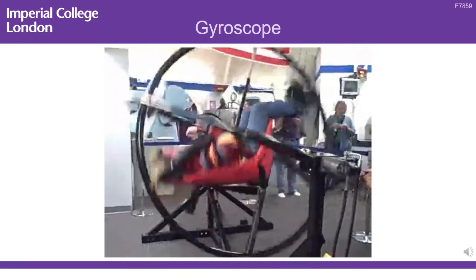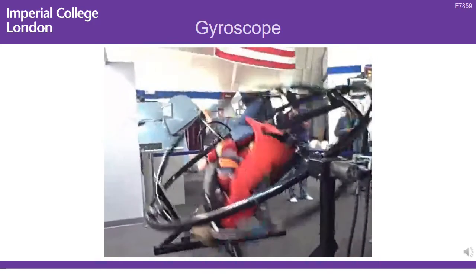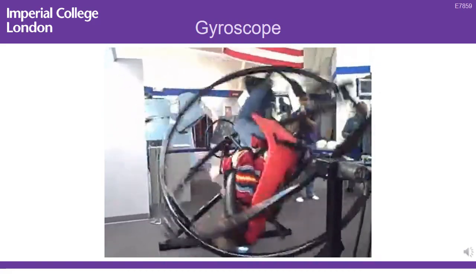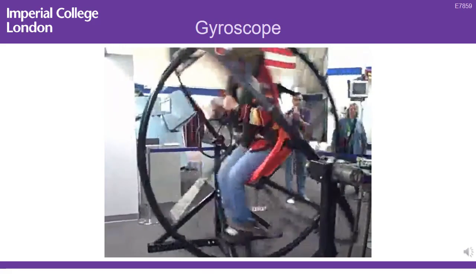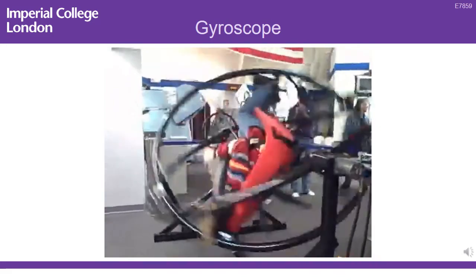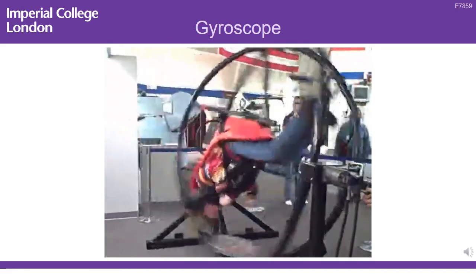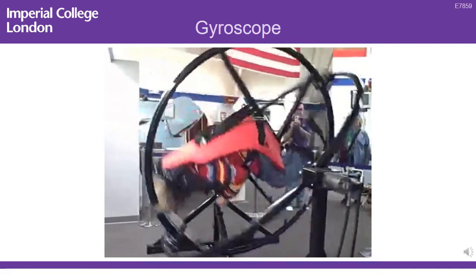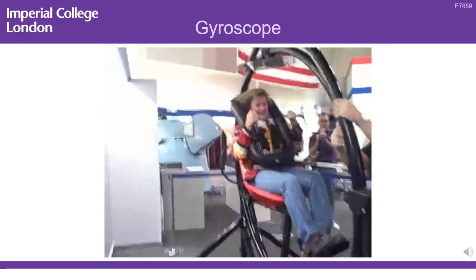Basically, gimbals are just pivoted supports that allow rotation of an object around a single axis. With 3 gimbals mounted together, each will offer a degree of freedom, so you get the yaw, the roll, and the pitch movements. This example has 2 black rings or gimbals. Not being a fan of upside-down spinning rides nor vomit, I was very relieved when we agreed not to spin the patient.